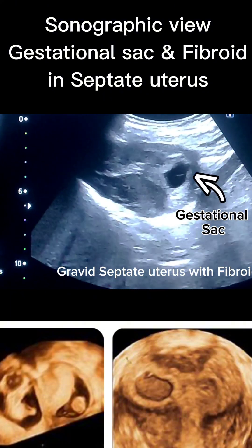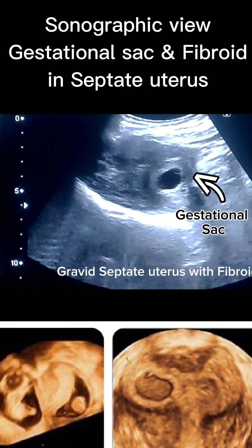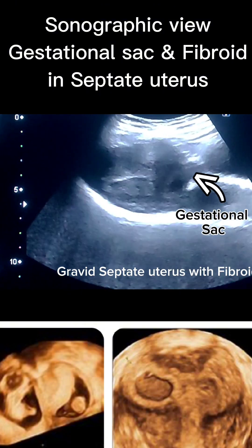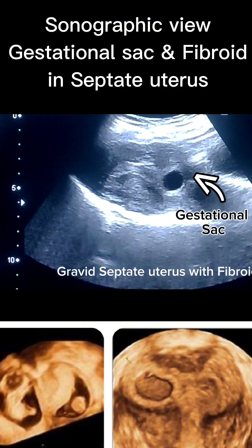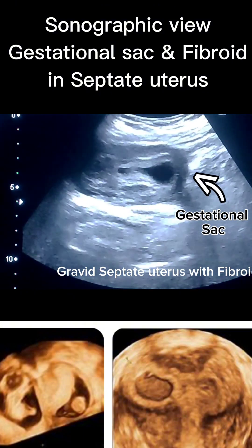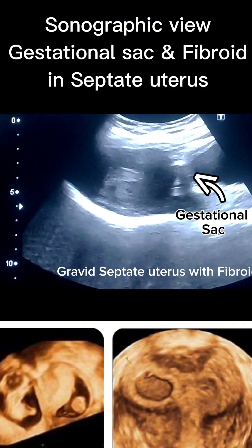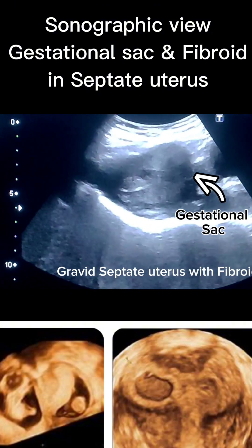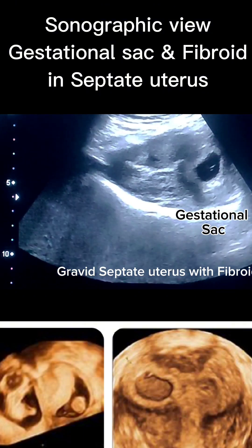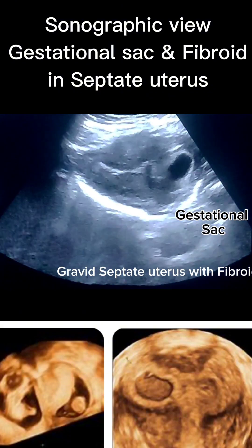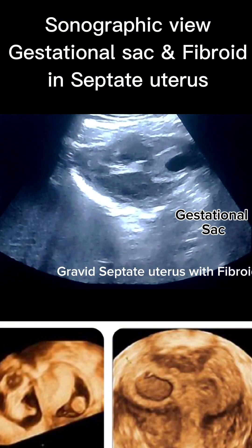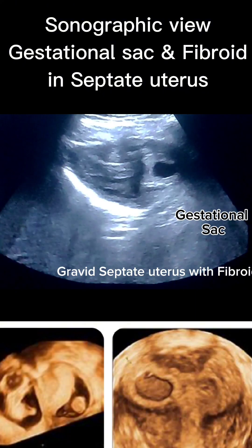The gestational sac appeared oval-shaped, surrounded by a healthy decidual reaction. A yolk sac is visualized and a fetal pole is also seen, measuring consistent with 6 weeks gestation. However, no fetal cardiac activity was noted at this stage.